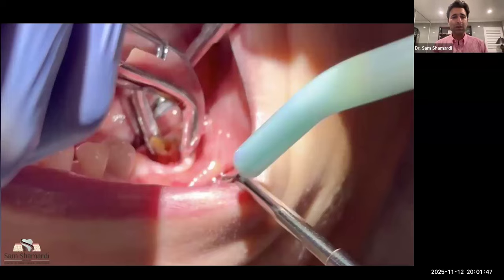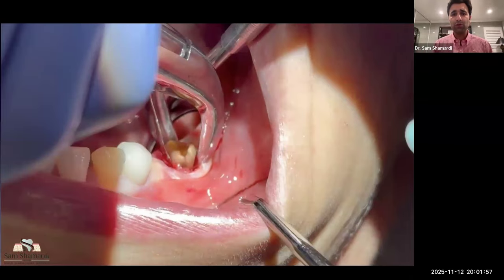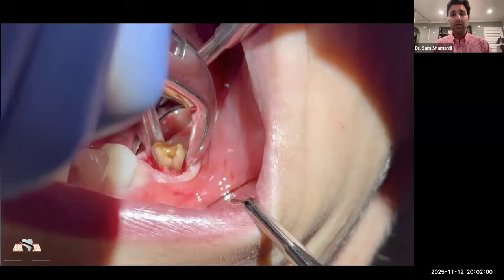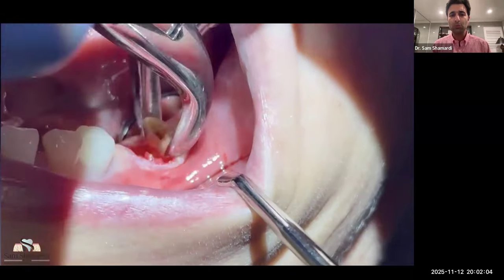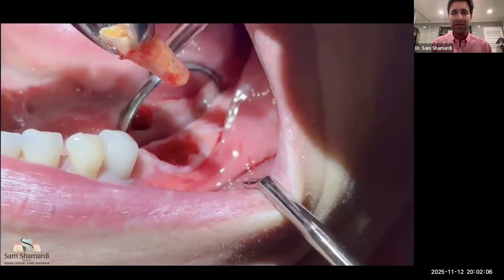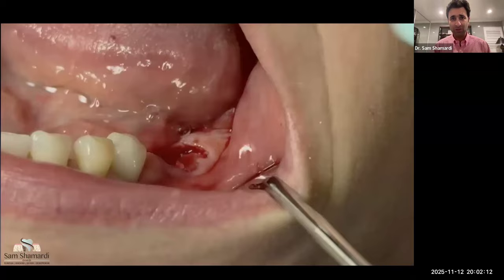So a quick example here on a tooth that had already had the periotome and the exotome work done. I'll show this video again in a little bit, but what you can see with our forceps is that once the bulk of the work has been done with the exotome, that tooth is already nice and mobile. So once we employ our rotational movement, that tooth is going to be able to be removed with a significant amount of less force, less energy, and more time efficient.